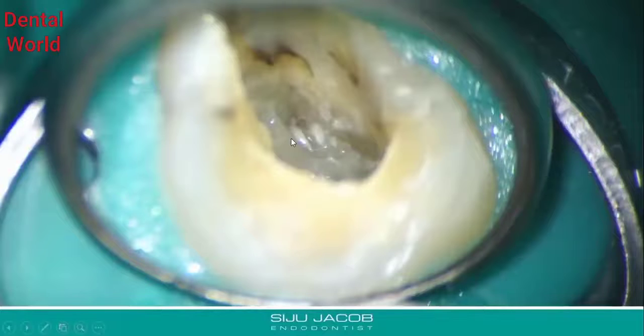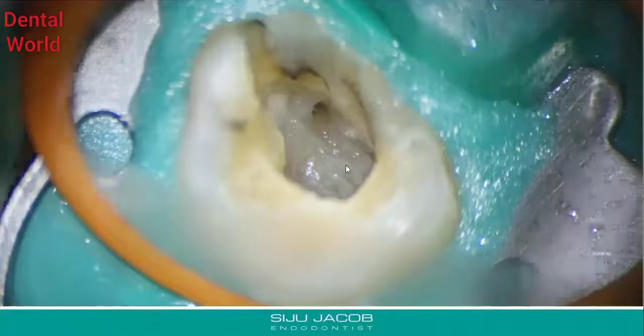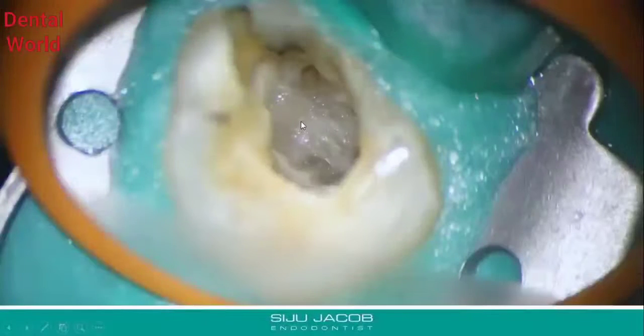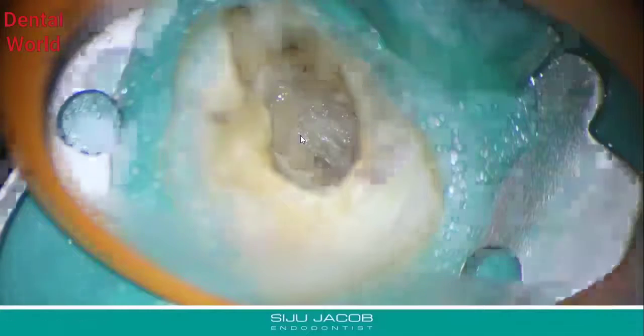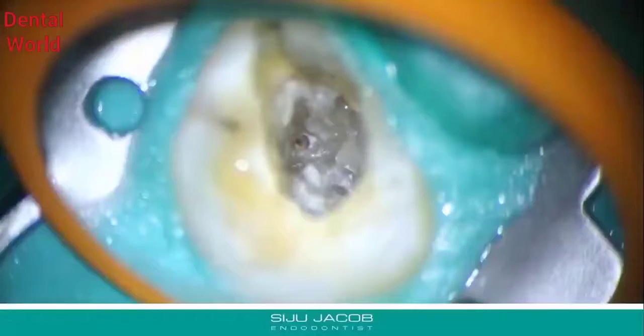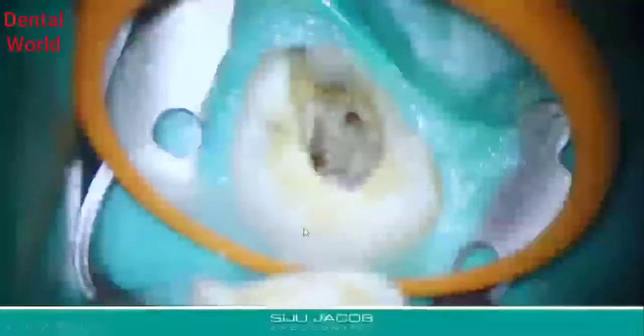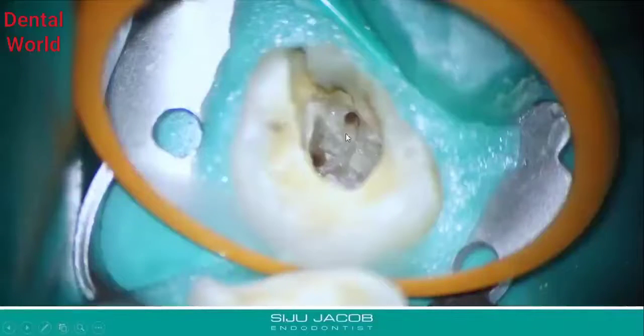So that's the mesiobuccal canal, and then we look for the distal buccal again. You can see evidence of a white spot over there. So we drill out this portion here, and sure enough, that's where the distal buccal canal is. So you have your mesiobuccal and your distal buccal, and then we just have a look at it from far. You can see mesiobuccal, distal buccal, and then the palatal down there.